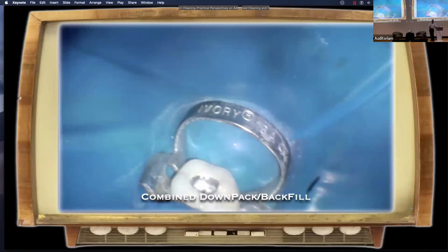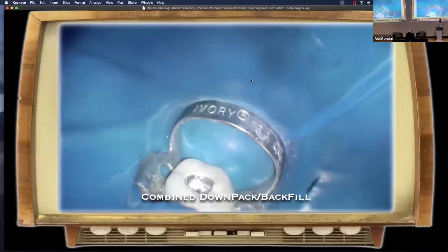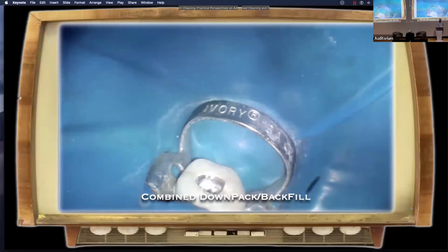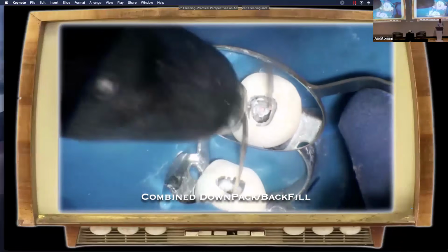I'm going to use the Obtura or Calamus, whatever you have. That's going to be my plugger. And you're going to use the smallest one that you have. The tip of that needs to fit in the orifice, so you're not going to get much in the way of hydraulics. And that's actually a little bit of a struggle sometimes. So here I come with the Obtura. Okay, the combined down pack backfill, I'm going to squeeze out some gutta percha to get that tip good and hot. And we're going to drop that in the ML.